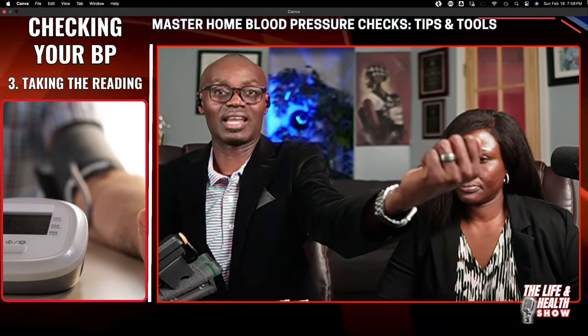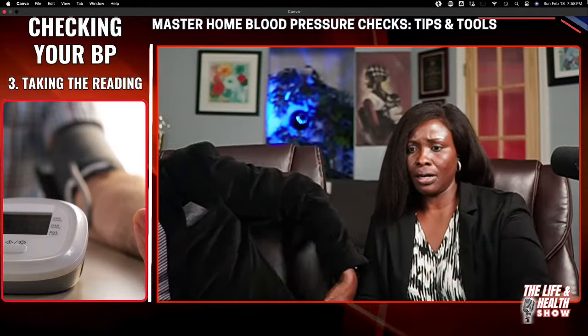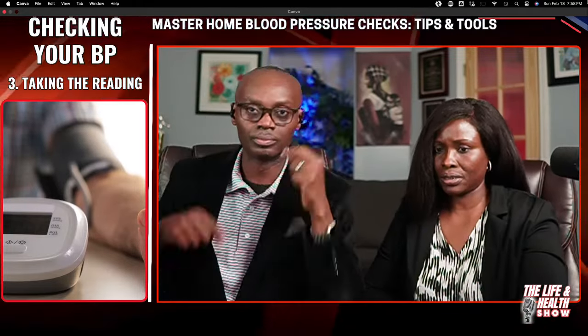So if you put it and it's like this, it's wrong. It has to be down enough so that you're comfortable. And your arm is also close to your chest, I mean, your heart level. Just make sure. The middle part of your arm should be in line with your chest area. So you have to find a table that is just right, not too low and not too high. So it will be right in the middle like this.